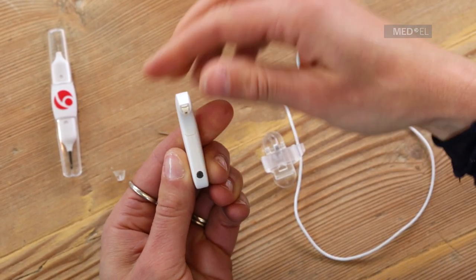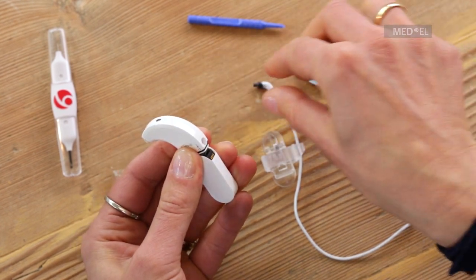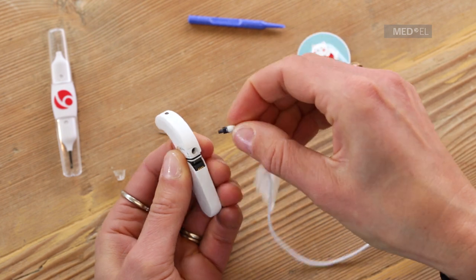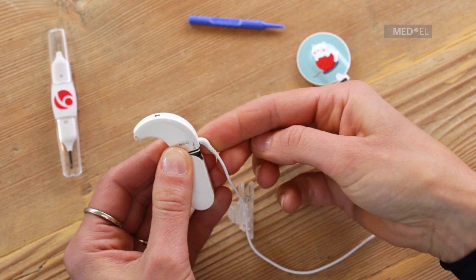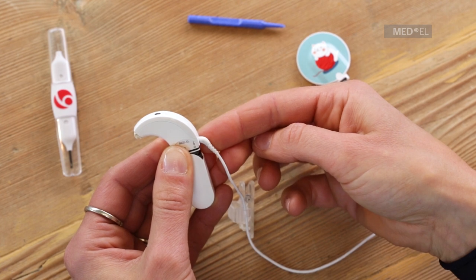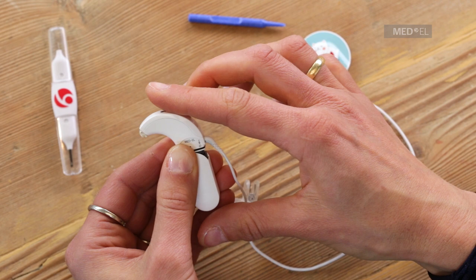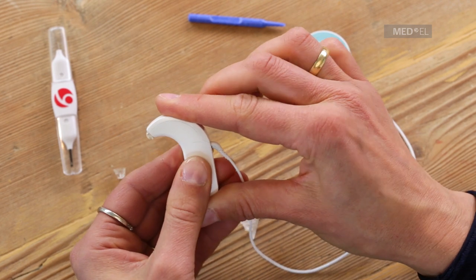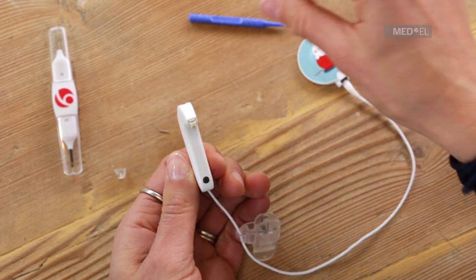Then slide the battery pack cover off slightly. Plug the cable into the side of the control unit, noting the correct orientation of the coil cable socket and being careful not to use too much force. To secure the cable, slide the battery cover back into position and lock into place.